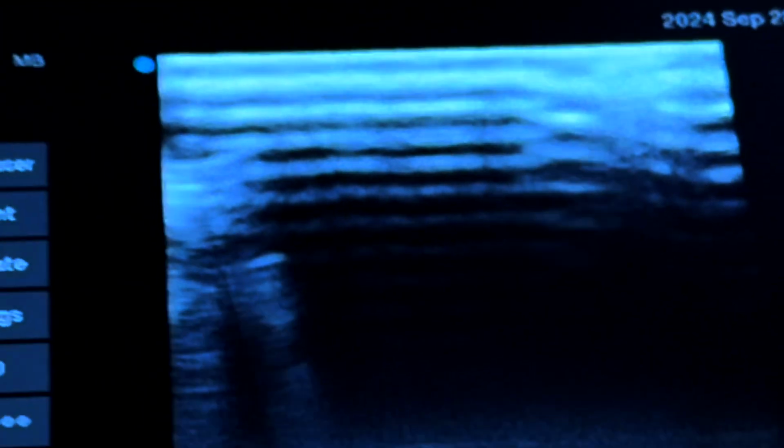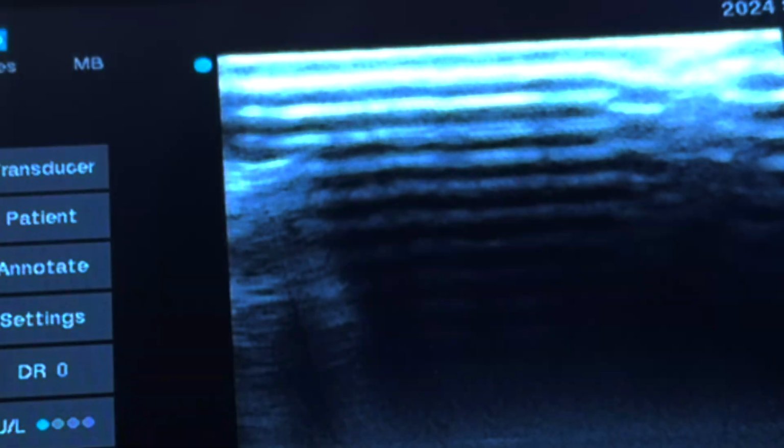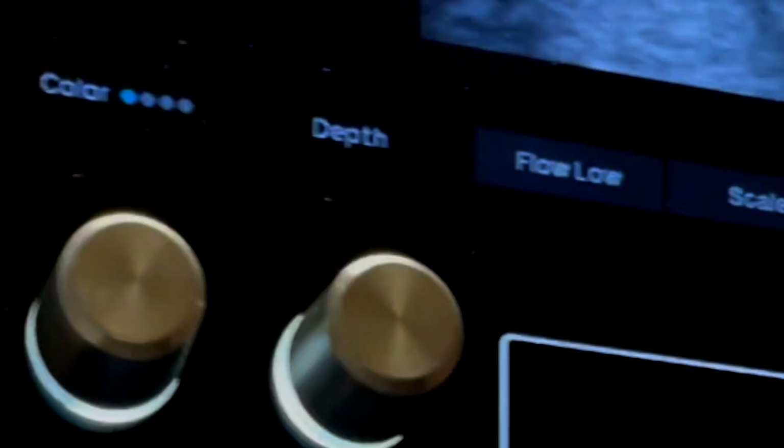If you see on the top of the screen there, the blade is in the abscess cavity, and I'm just going to make a cut. I can see the tip of my blade, so I know I'm not going too deep. And I'm just making that cut across. And notice to the left there, that circular structure is a vascular structure there. So that's exactly why I like using ultrasound, just so I know what I'm doing at all times. But if it's superficial enough, you'd be safe to do it at bedside without using ultrasound. And now you just go ahead and drain your abscess as you normally would.